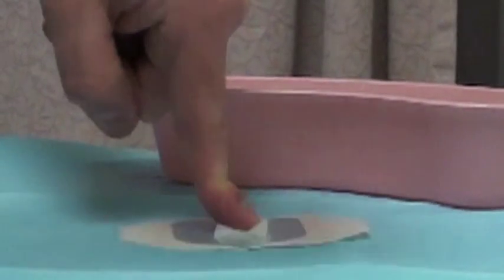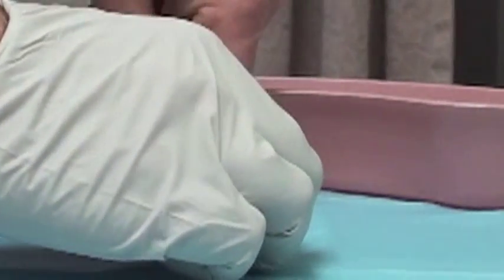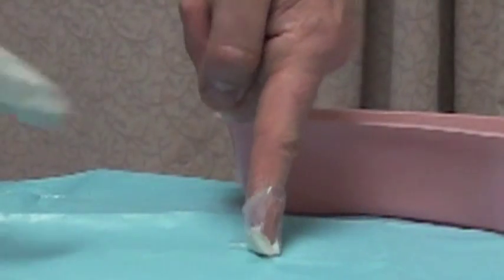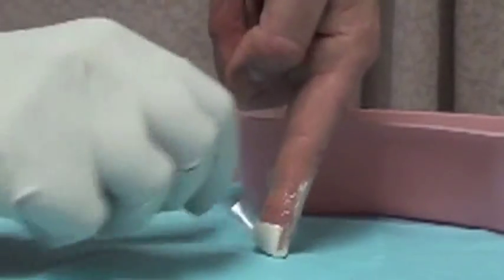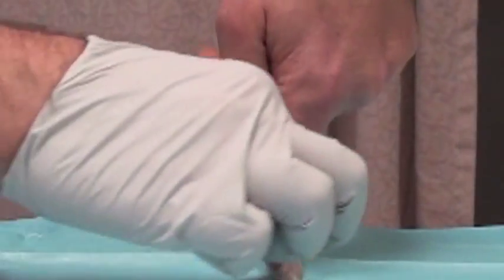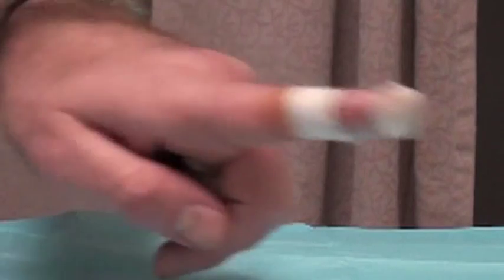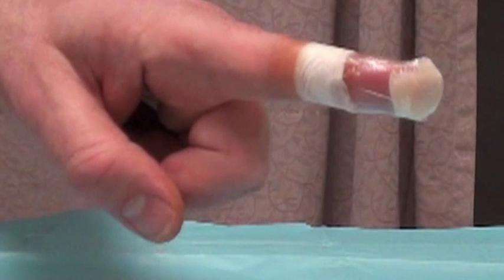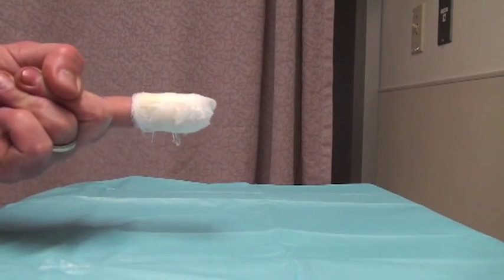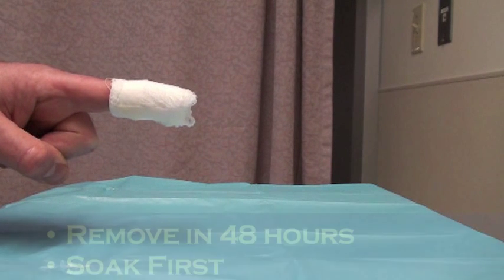Next, fold up the two sides of the tegaderm, then peel off a little cardboard backing and gently wrap it around the finger. If you have it, put a little benzoin on the skin just proximal to where the tegaderm is, and then wrap the whole edge firmly with a steristrip to create a leak-proof seal. Then wrap everything over with a gauze wrap, mostly to hide the scary blood from the patient, and tell them to leave everything in place for 48 hours.